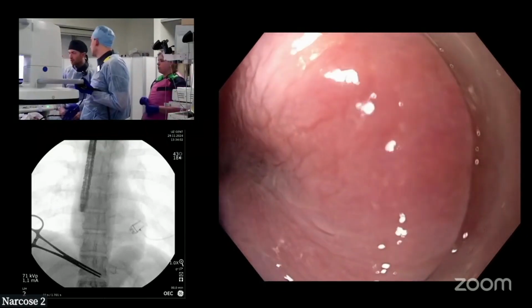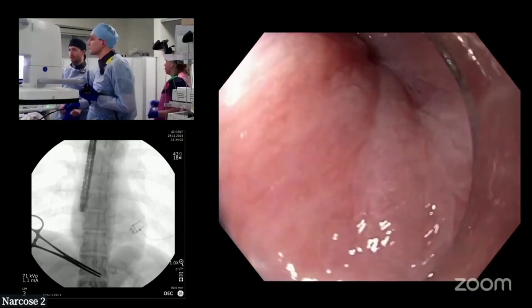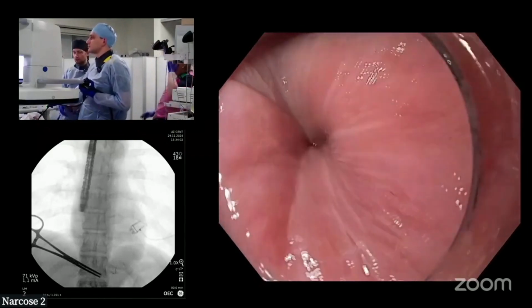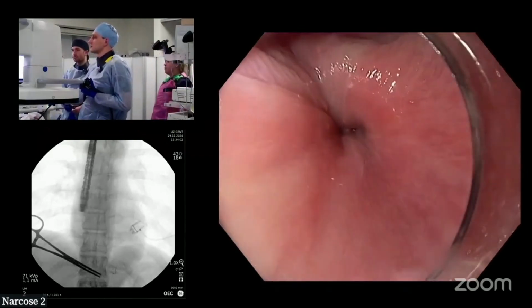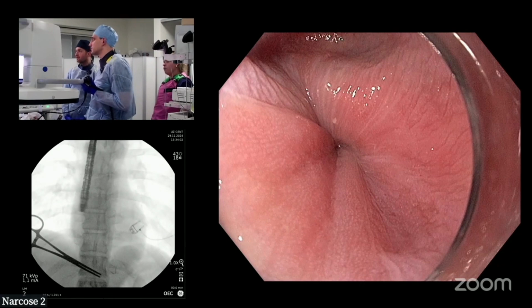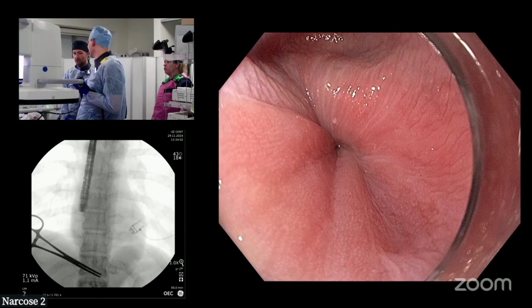Fundoplication, you mean? Yeah. So the issue is the fundoplication. Of course, there are two issues going on here. It could be the LES, incompletely treated lower esophageal sphincter. Could be the wrap that's too tight, and therefore with POEM you will only treat the LES. You will not treat the wrap. With balloon dilatation, you will treat both. Exactly. So that's the reason for using balloon dilatation, not POEM, because I do, as you well know, prefer to use POEM in a young patient if I can.